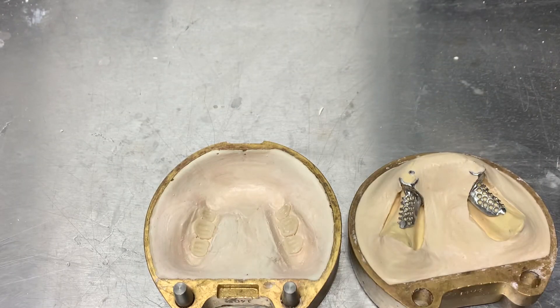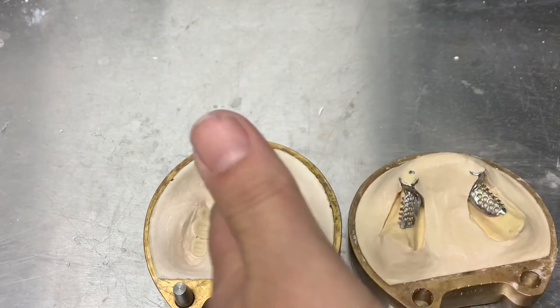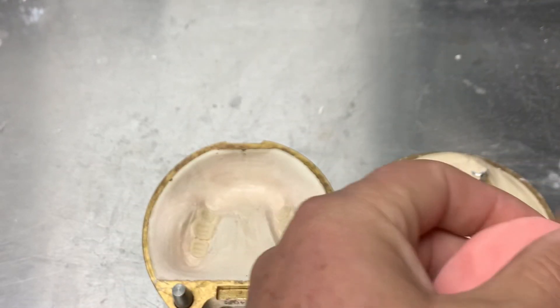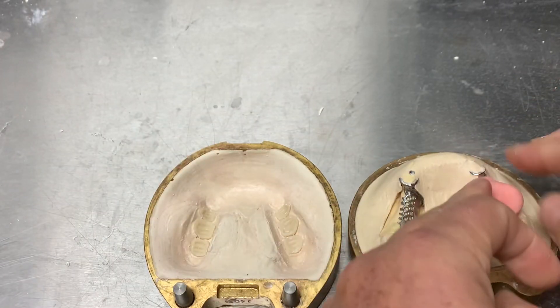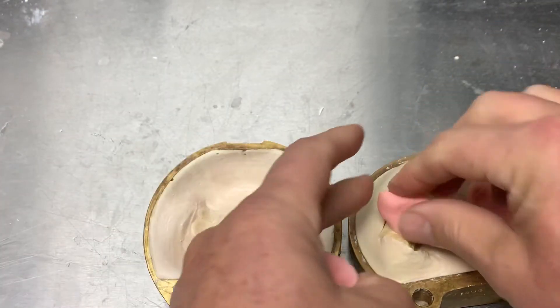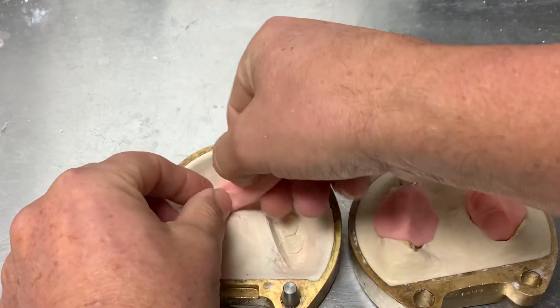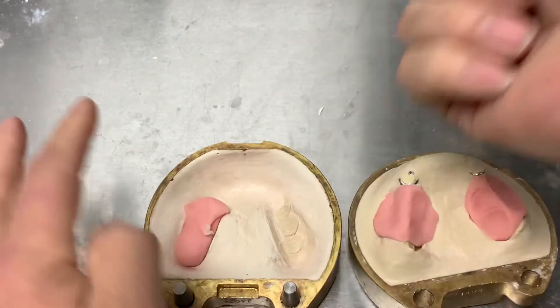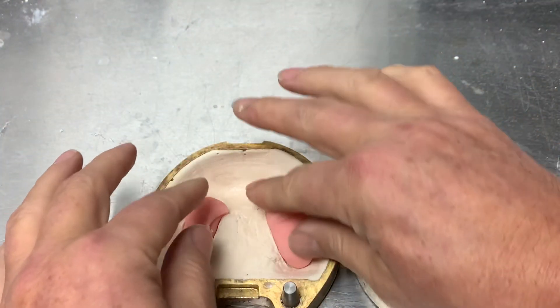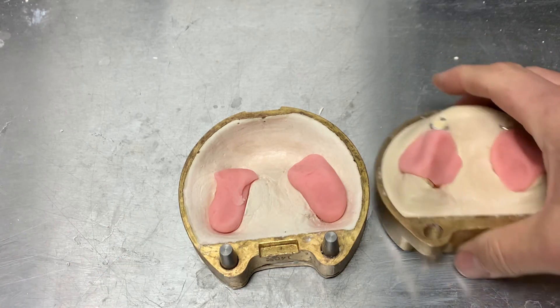I'm going to knead it well to make sure that doesn't happen. Make sure your hands are obviously very clean — we don't want any debris inside the acrylic. Now, a little displacement theory: I'm going to apply it in all four sections. No trial packing, so I have to ensure I have enough acrylic — which I think I can manage, since I've mixed enough for a full denture with plenty left over.